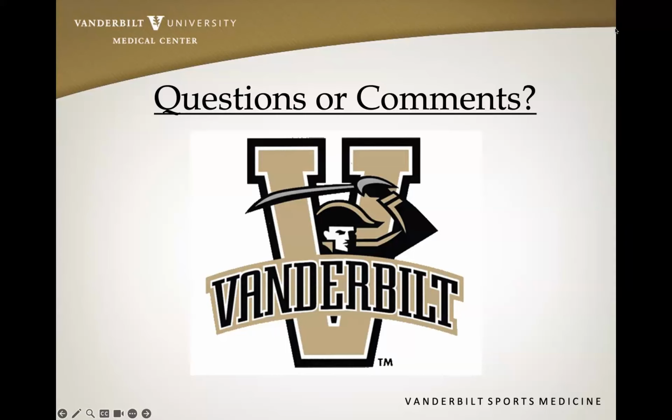As far as just the scapholunate portion goes, that's a challenging one, right? We can see the dorsal ligament really, really well, and you can make a great call on pathology there, and you did. It always is a little bit of a question of, is it enough to just see that the dorsal ligament is intact? Are there injury patterns where people tear the interosseous portion of the scapholunate without tearing the dorsal? And I've always wondered a little bit about that. I think the dorsal tends to be one of the earlier injuries that are associated with the instability.